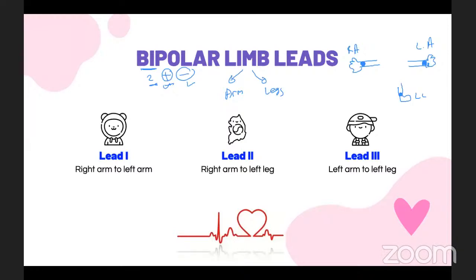So there is a need to neutralize. That's basically what you need to do, okay? Because when you have positive and negative charges, this could cause excess charge going into the human, right? If there's an excess charge, this could cause problems. So what we need to do on the right foot or the right leg, we add an electrode known as the earth or grounding electrode. We earth the person or we ground them to remove any excess charge. We don't want excess charge, okay? But anyways, it's not important in the leads, so we'll just erase it for now. This is just for your knowledge, okay?